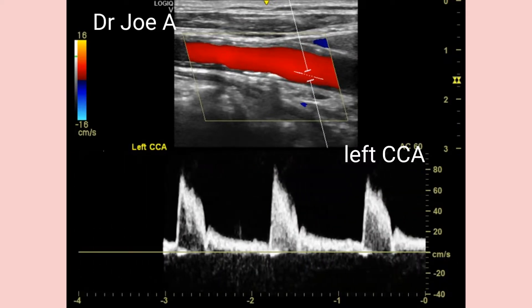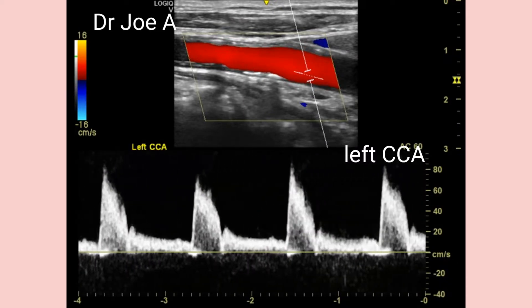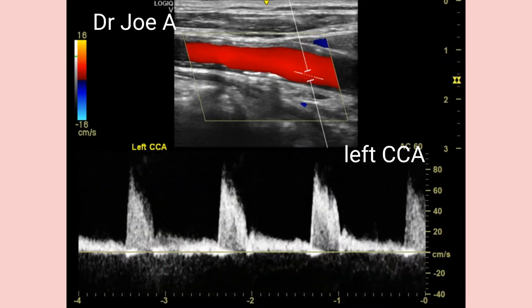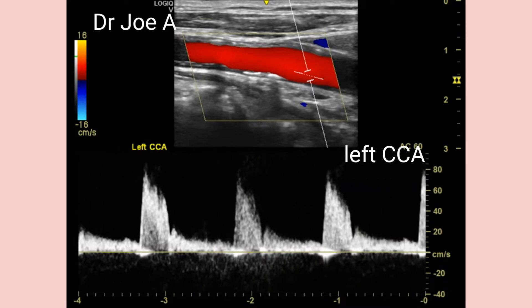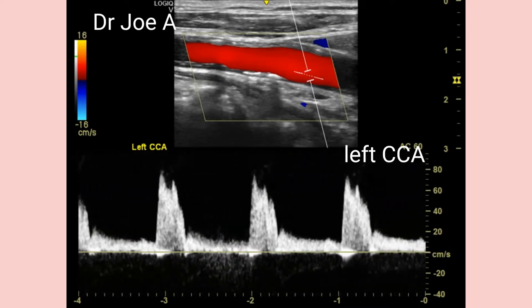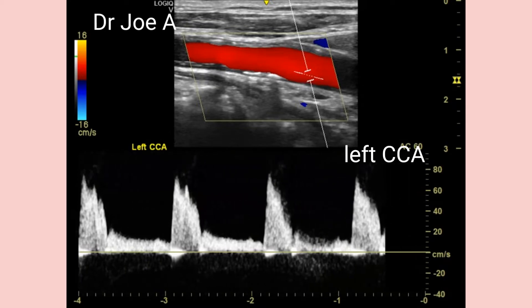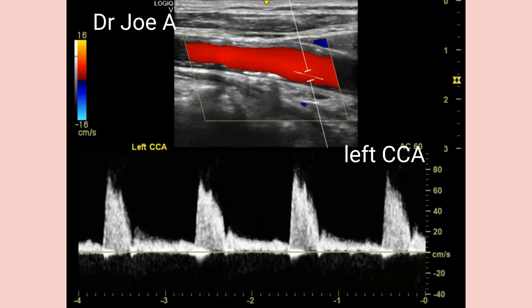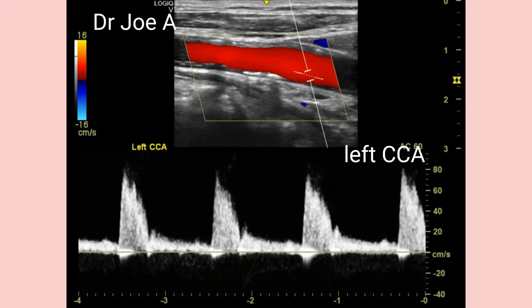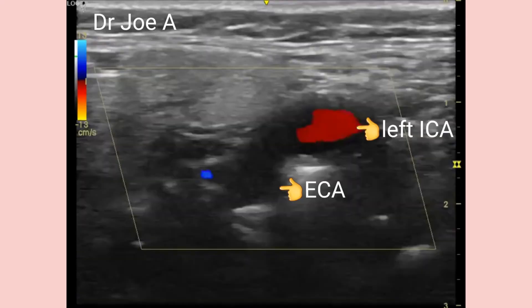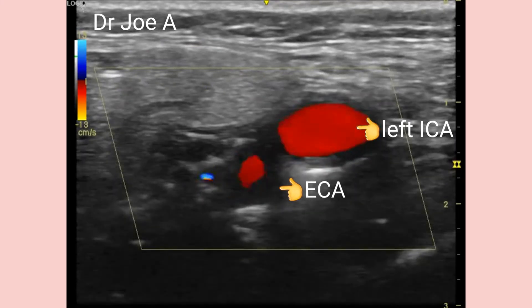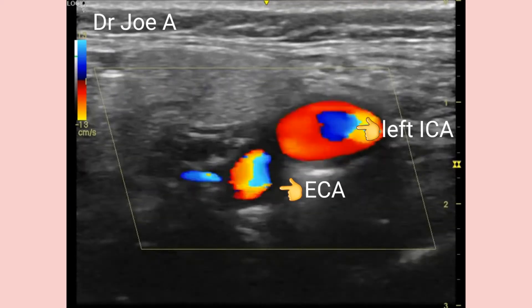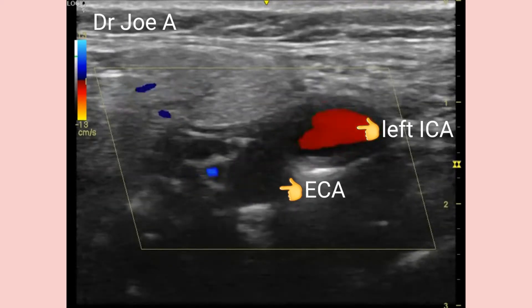Spectral Doppler of the left common carotid artery also shows normal flow and waveform. The left ECA shows absent flow during diastole, which is normal. The left ICA shows continuous flow during diastole, which is also normal.